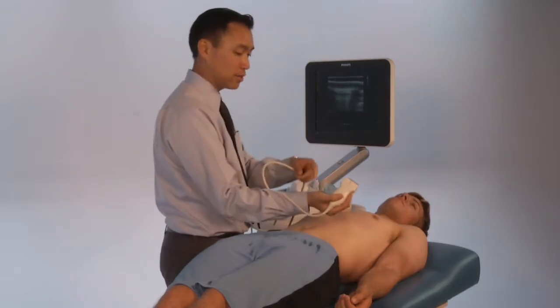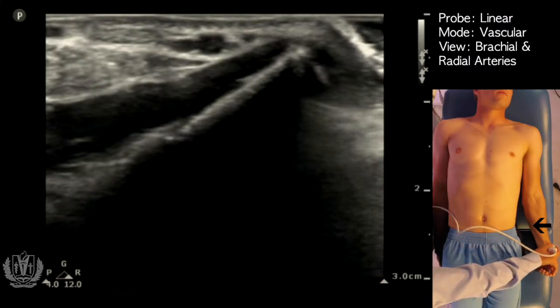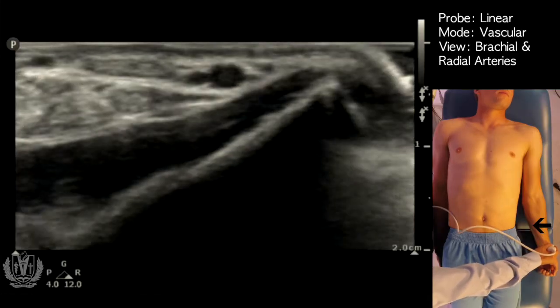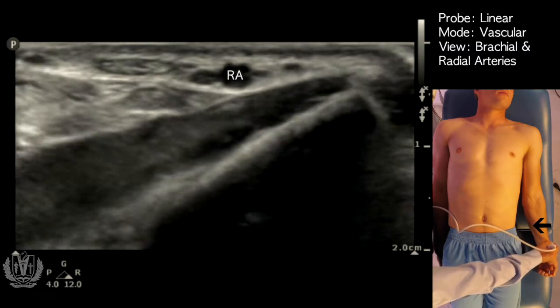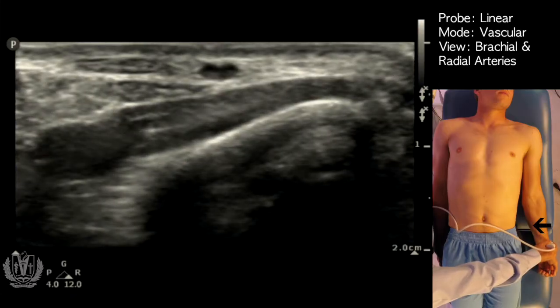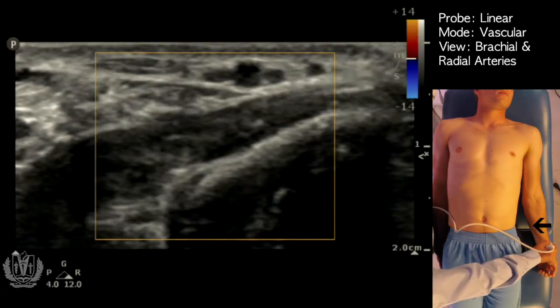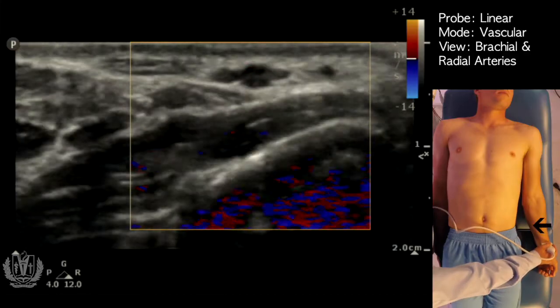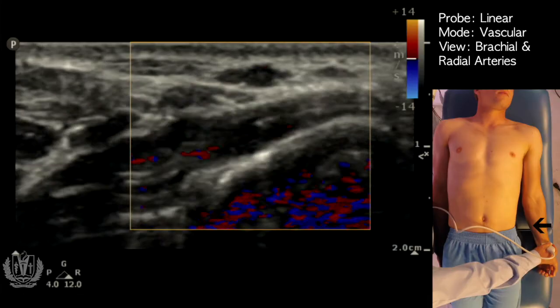Here the indicator is towards the patient's right, and at the very top of the screen, that is the radial artery. If I compress, you can see that the veins compress next to the artery, but the artery is still pulsating. That's the radial artery. If you put color flow on it, you see red flow in the artery during systole.